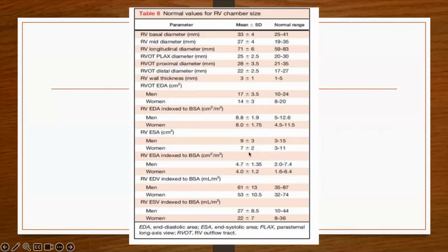As I was reading the finer points in the guidelines, it looks like the studies that looked at these normalized numbers based on the body surface area did not uniformly use the reference points for the RV focused view.